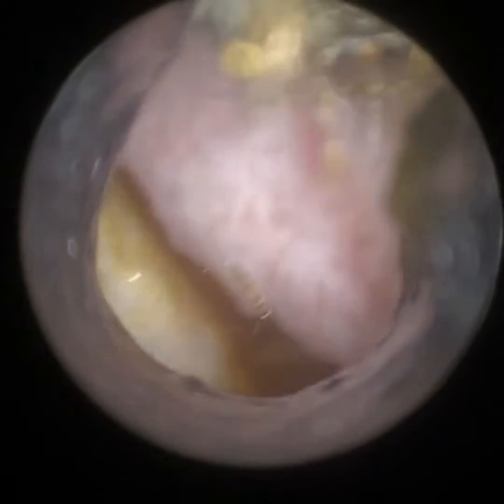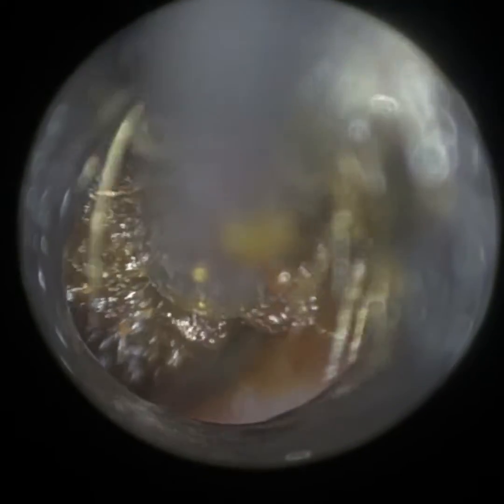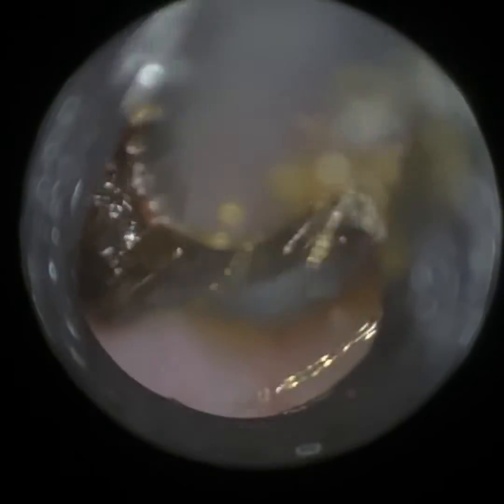The benefits of the endoscope — and if you've been watching the videos it's clear to see already — is the wide field of view an endoscope provides. Using an endoscope has revolutionised my career and it's been a game-changer. Prior to an endoscope, I only ever examined the ear using an otoscope, which is the normal ear torch a doctor examines your ear with. That's what we were trained with. So when I first used an endoscope, I was able to see parts and definition of the ear I'd never really experienced before, and it really changed my clinical practice and career.